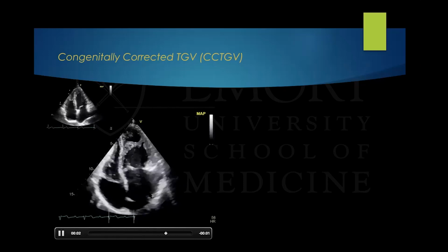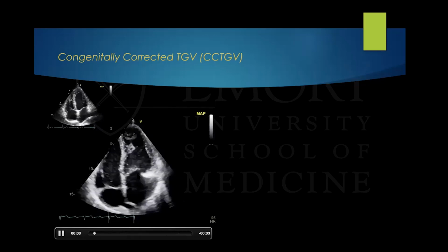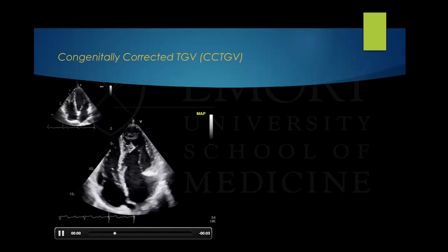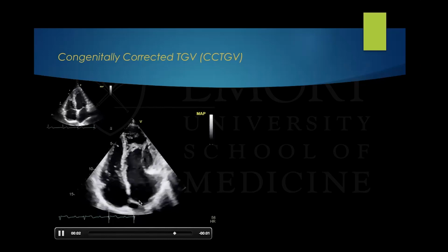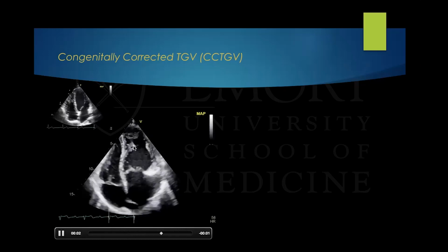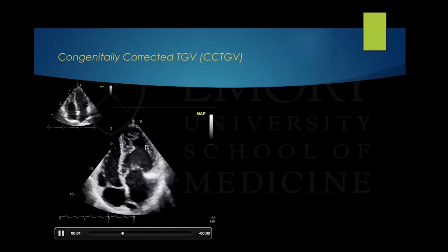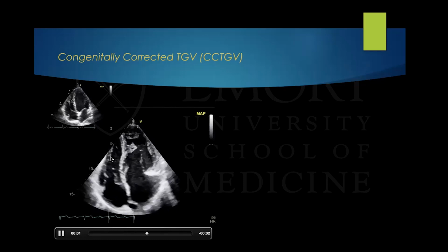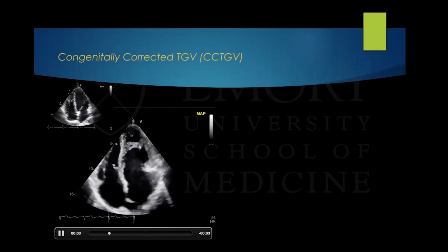You will see that there is the left atrium that appears to be dilated, most likely because there is some mild Ebstein anomaly of this tricuspid valve, and there is a degree of TR. And then here, the right ventricle function is preserved, and you see a moderator band right here along the mid ventricle. This is the right atrium through the mitral valve into a normally functioning left ventricle.